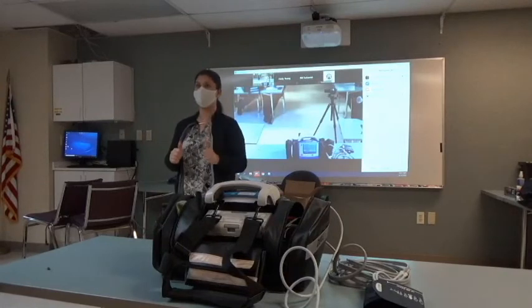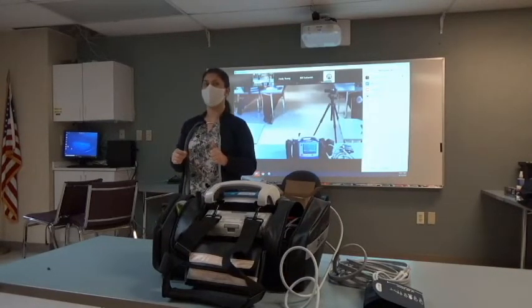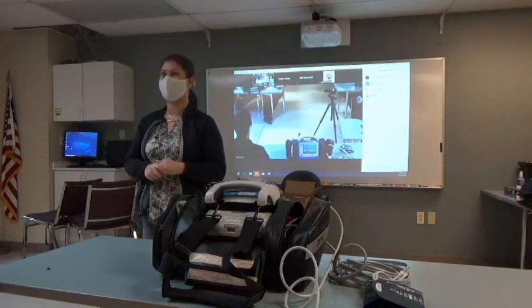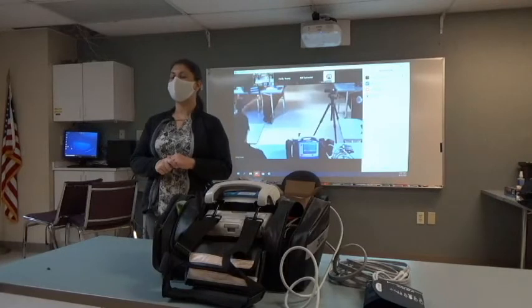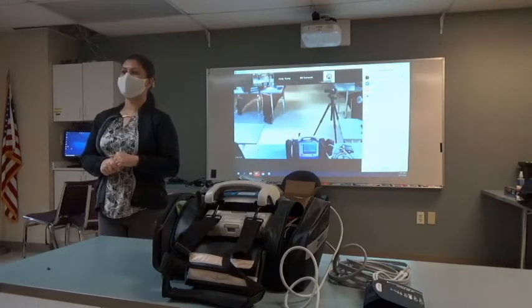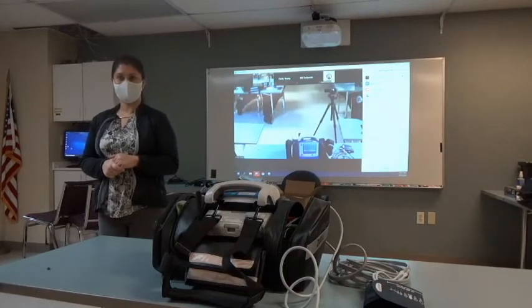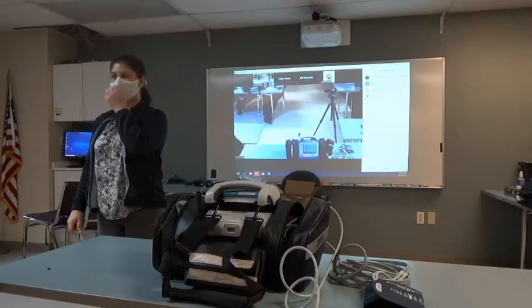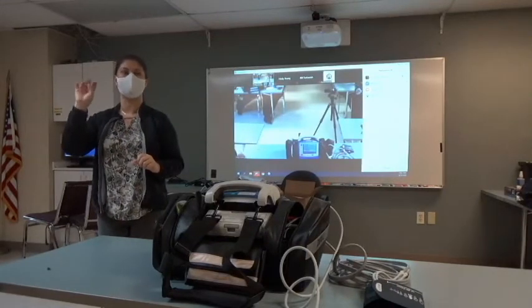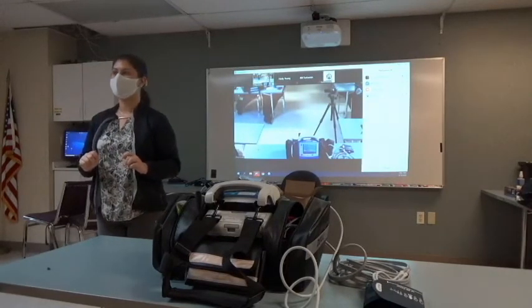Okay, we good with manual defibrillation? We can move on? Yes. All right, so on your rhythm generator, if you move one button push over to VTAC high, we're going to get into cardioversion. You're going to press the sync button on the left-hand side by the apps. You're going to get all your markers on the screen. Sync is going to be flashing on there as well.